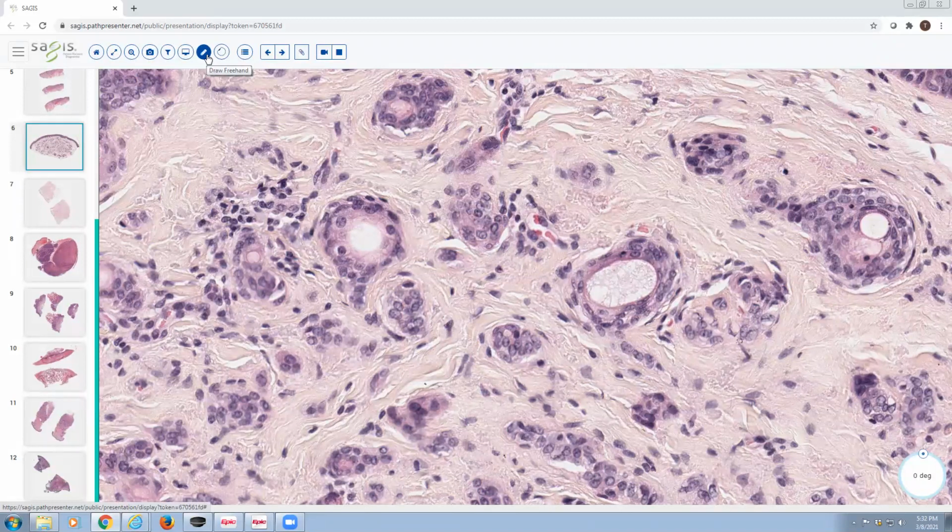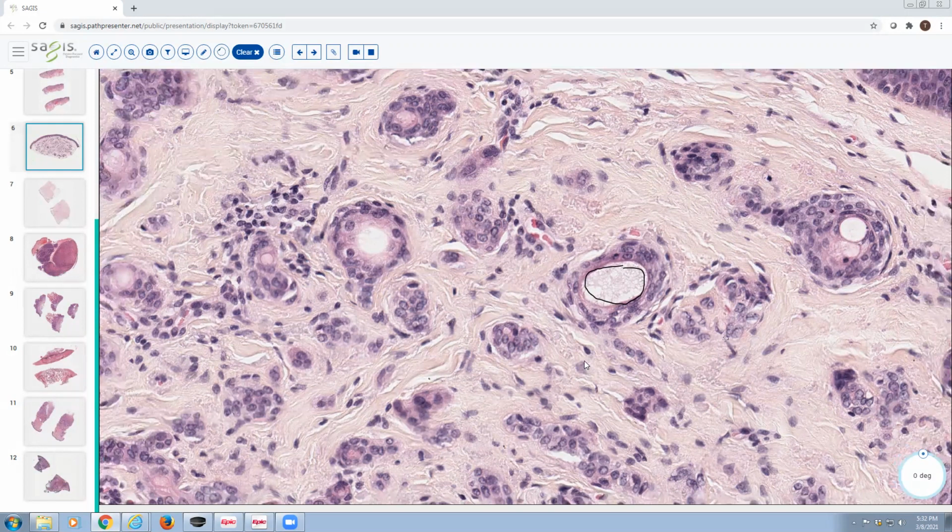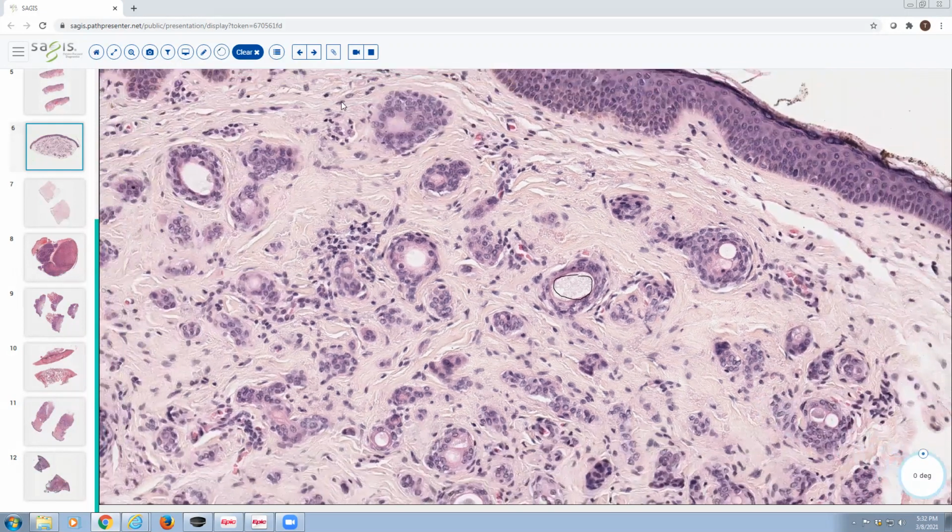In a duct, you're going to see more of a spongy gray material that's not really organized in a concentric ring. It's more loose and has this spongy appearance, and it's got more gray color than pink. That's eccrine sweat. Here's a good example of it here.